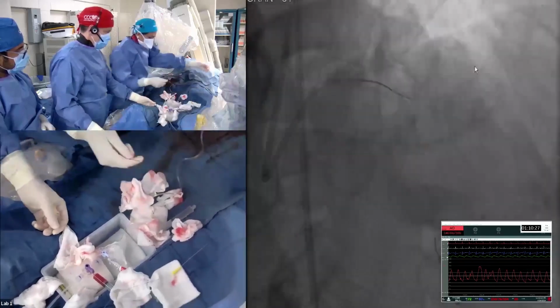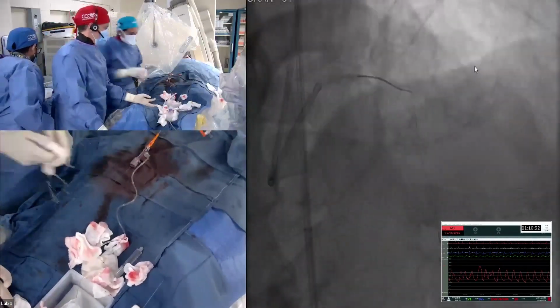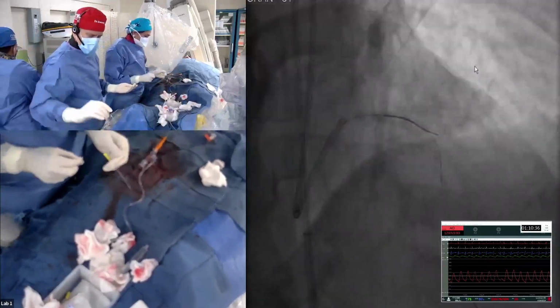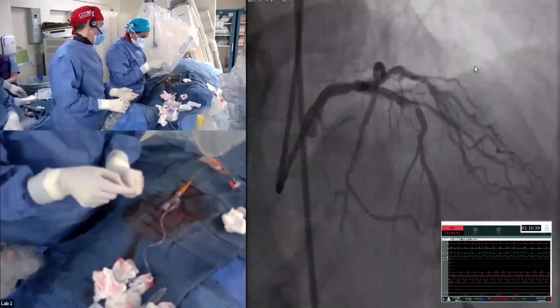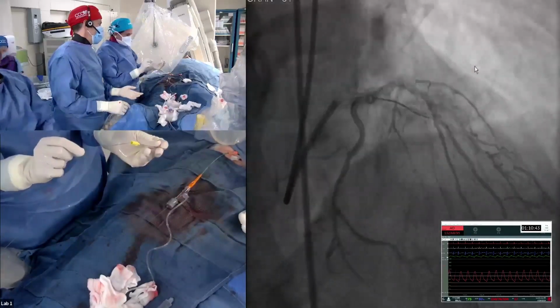You gave the 2.5, right? High pressure balloon we wanted. We didn't open the cutting balloon. I'll really wire the diag. This is a key point: just because it looks great on atherectomy, seldom do I go right to a stent. I always feel like it still needs more prep work.